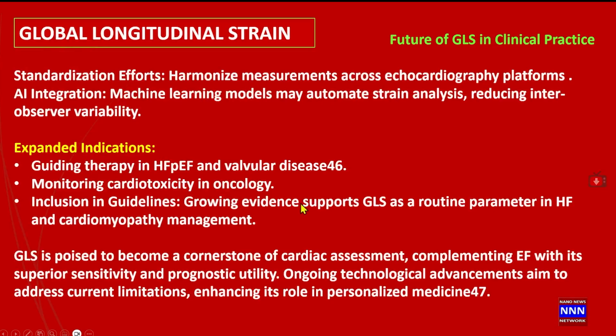So the expanded use will be in patients with preserved ejection fraction heart failure, monitoring cardiac toxicity, and inclusion in the guidelines as a routine for evaluating left ventricular or regional left ventricular function while doing echocardiography.